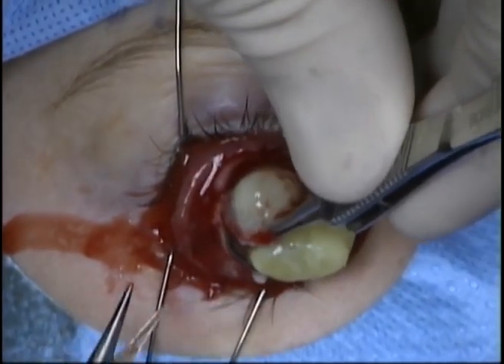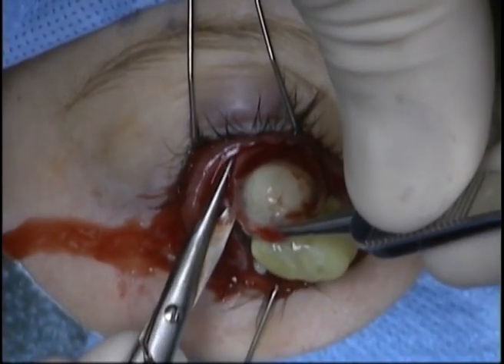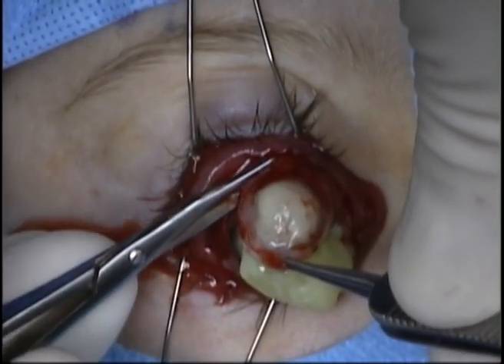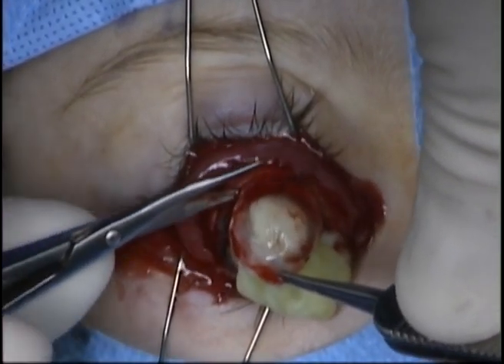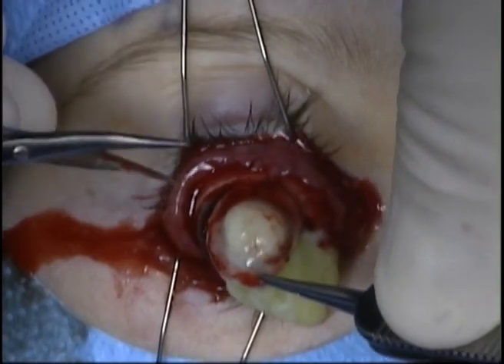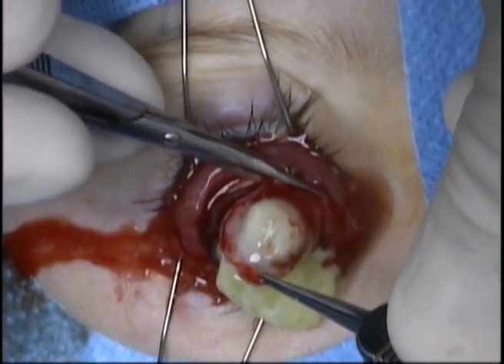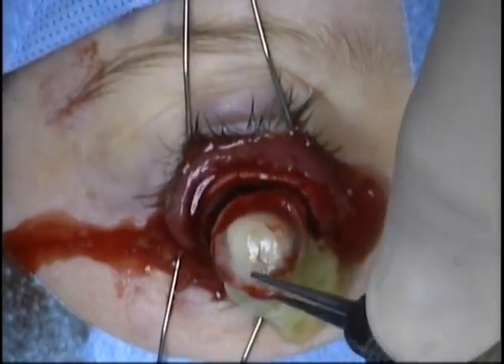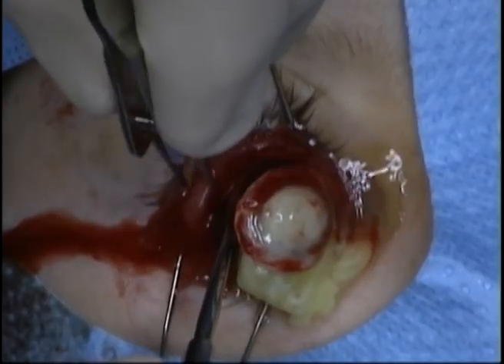The purulent material from the endophthalmitis is noted. An evisceration spoon is then introduced into the suprachoroidal space, and the contents of the eye with the cornea attached are removed and sent to the pathologist for evaluation.